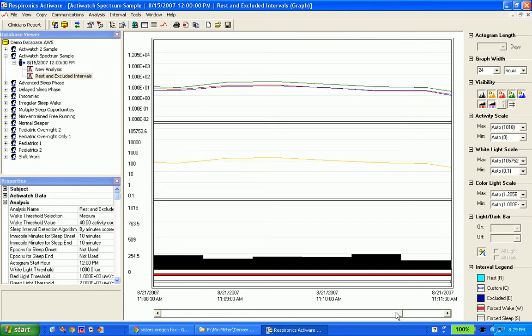It just tiles all of those picture boxes together. Sometimes you may have as many as 100 of them, times 32,000. It's a huge number of pixels. It's a huge data set to deal with, but it was the only way that we could discover to make it work. And it was a lot of work, but it was very, very effective.